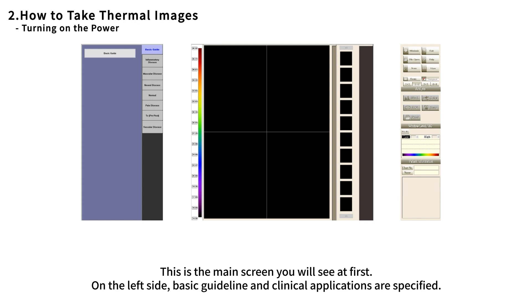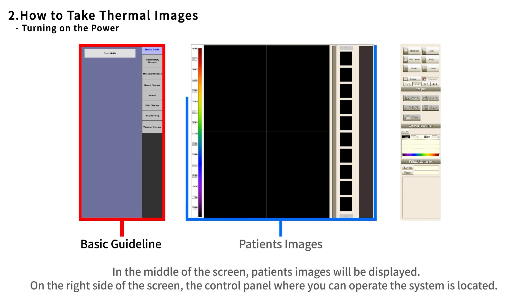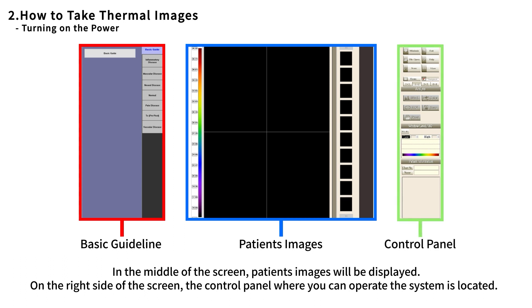This is the main screen you will see at first. On the left side, basic guidelines and clinical applications are specified. In the middle of the screen, patient images will be displayed. On the right side of the screen, the control panel where you can operate the system is located.